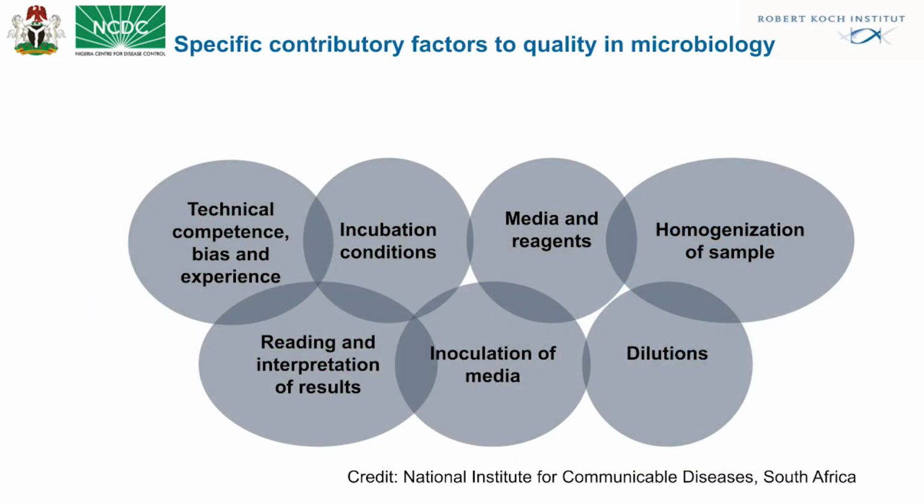Specific contributory factors to quality in microbiology. The following are contributory factors to quality in our microbiology laboratory: technical competence and experience. The scientist must be competent and have experience in what he or she is doing.